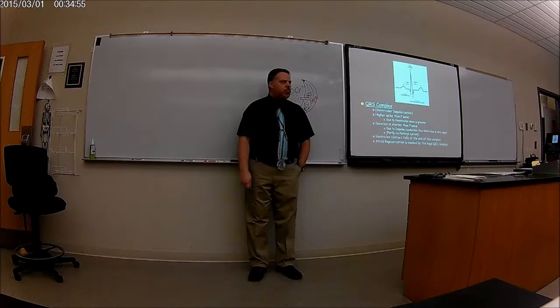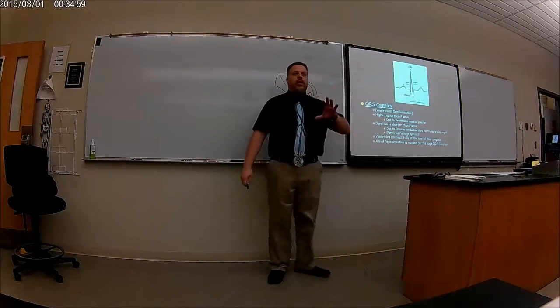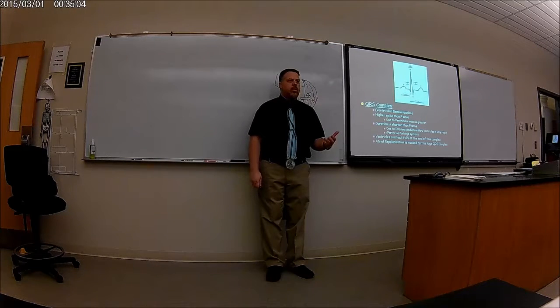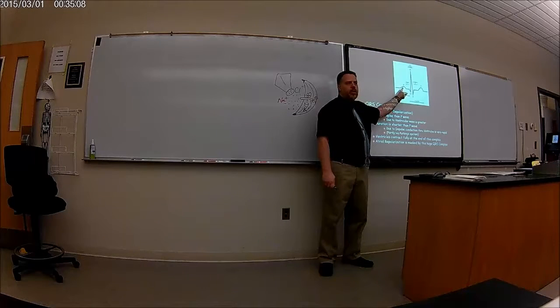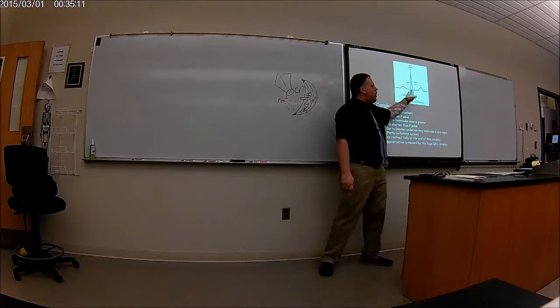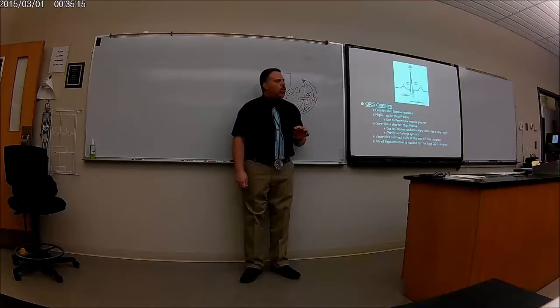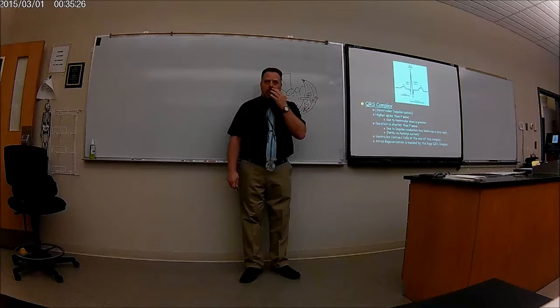Okay? So when the atria relax, we call that atrial repolarization. Okay? So the P wave is atrial depolarization or atrial contraction. The QRS is ventricular depolarization or ventricular contraction. But also in there, you're going to get atrial relaxation or atrial repolarization. All right?